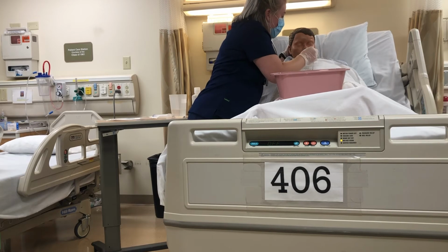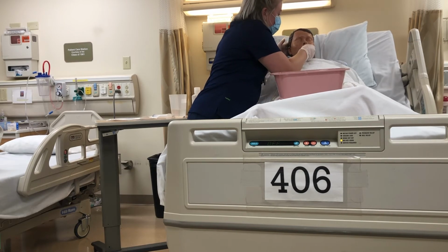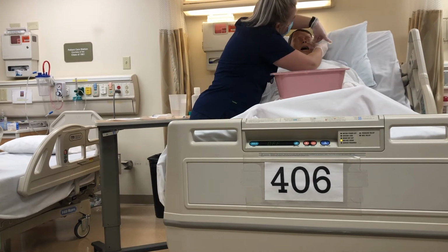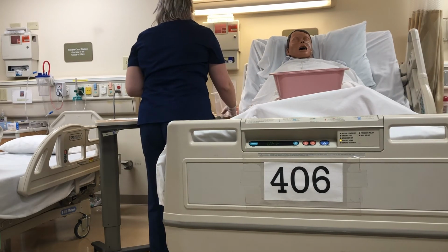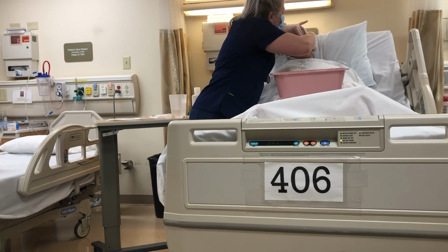Good. Right about our 64 mark that we had talked about. How are you feeling? Okay, great. Alright, I'm going to tape this to the patient's cheek just to ensure that it stays there for the time being, and then I'm going to tape it to their nose. Are you still doing okay? Good.